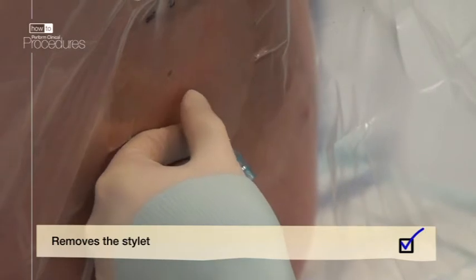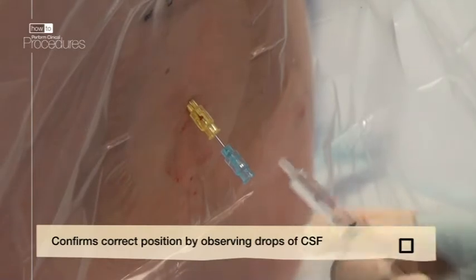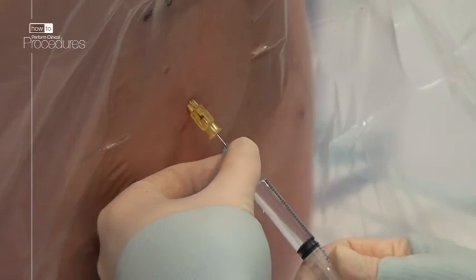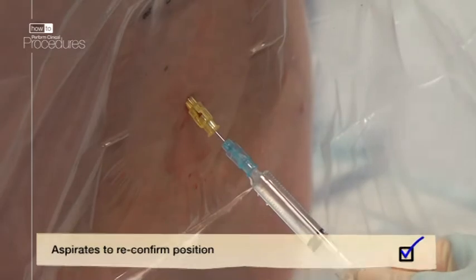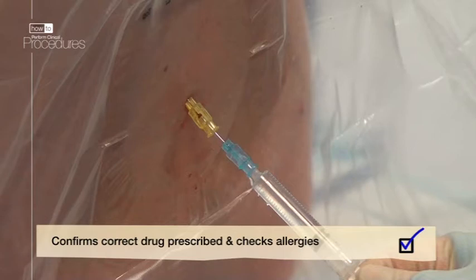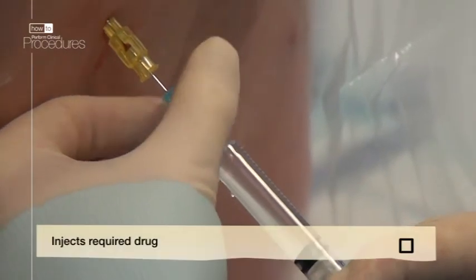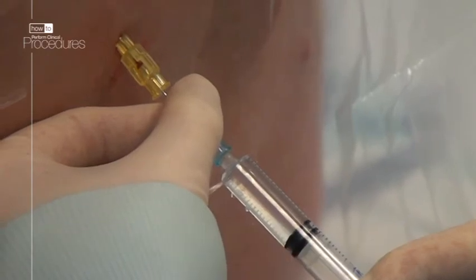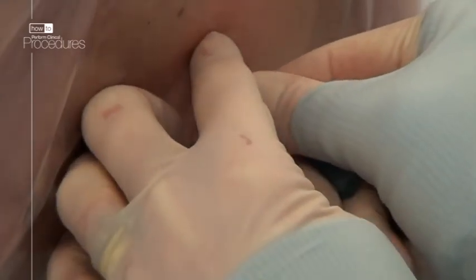Once you think you're in the right place, remove the stylet and wait. You know you're in the right place when you see drops of clear CSF dripping through the needle. Take your syringe full of local and use it to aspirate a milliliter or so of CSF, just to confirm that you're still in the right place. Confirm again that you have the correct medication for the correct patient and that you have excluded any allergies. You should rest your hand against the patient's back to maintain stability. Then slowly inject your drug, which in this case is bupivacaine, to give spinal anaesthesia. Once the injection is complete, withdraw your needles and press on the puncture site.